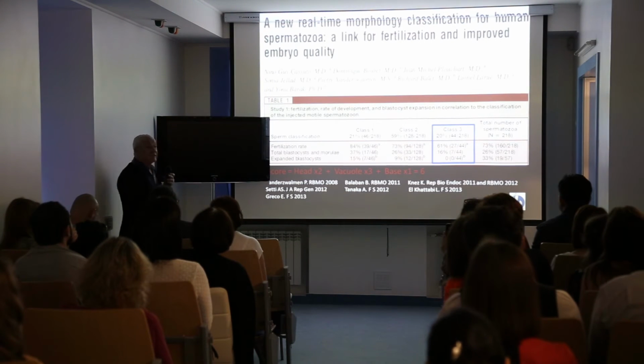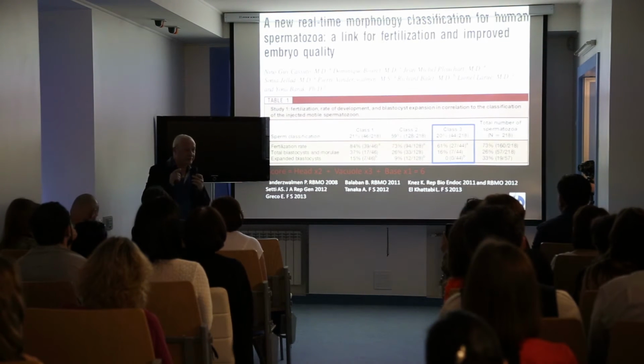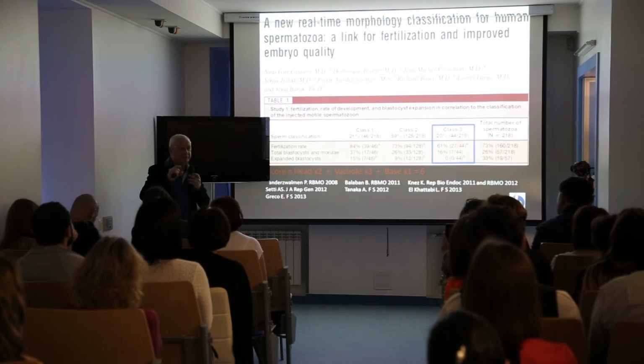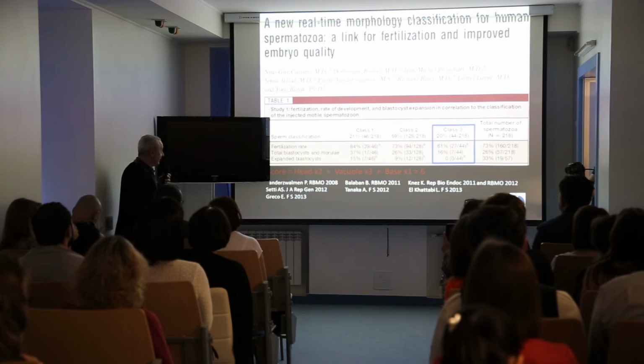Because this is how ICSI works. ICSI is not for everyone, but there is a difference. It's according to the quality of the sperm. Sometimes you need a high magnification to select the best one.